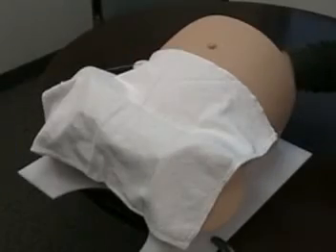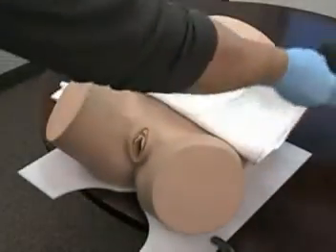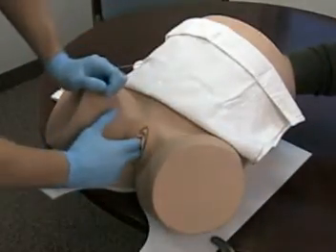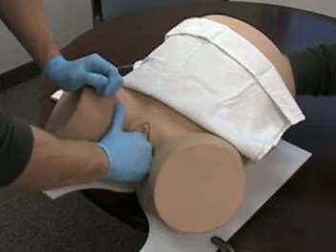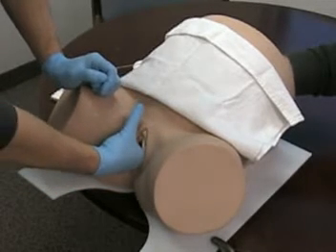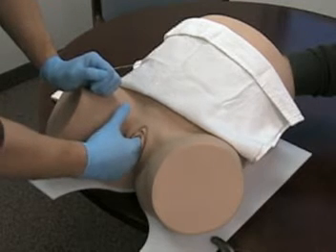Step 1 is confirming position of the fetal head. To confirm position of the fetal head, a vaginal examination is done to identify the landmarks on the fetal head, including the sagittal suture and the posterior fontanelle. This infant is currently in a direct occiput posterior position.